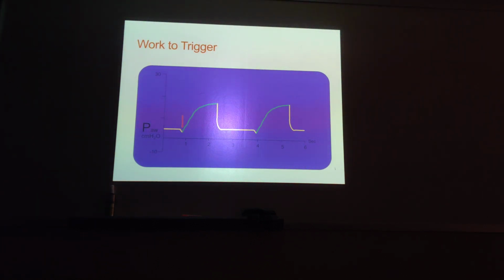And the amount of dip down will depend on your sensitivity level. Like if I set it on -3, I expect this to go down further before it goes up. If I set it on -1, it will not go down as much compared to -3 before it goes up. So that's how we know which breath is spontaneous, by looking at the deflection in the negative direction.